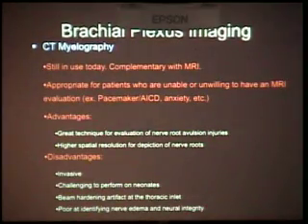And it always helps whenever you're imaging these patients if you know what side the deficit is. I can't tell you how many cases I've seen where they just put, brachial plexus imaging trauma, and you don't even know which side they're worried about. And that's really helpful for MRI because you want a coronal to compare both sides, but for the part that you really want the good high quality images of, you'll want to know which side. Then you don't waste your time imaging both sides, and you can get the patient off the magnet faster and you'll get a better study.